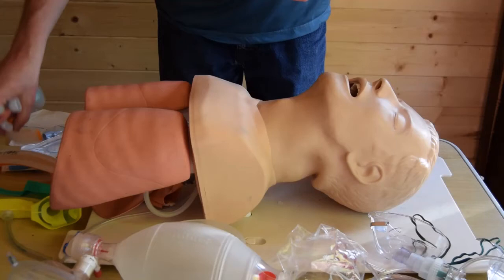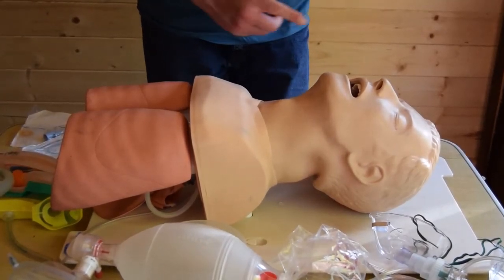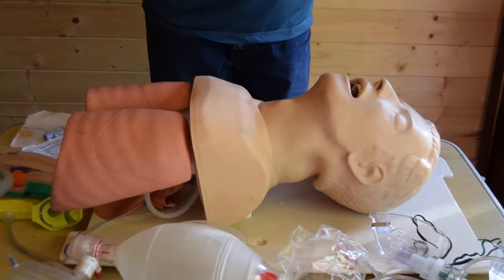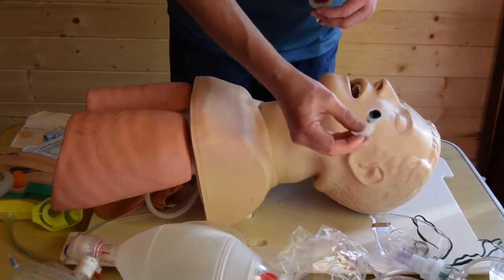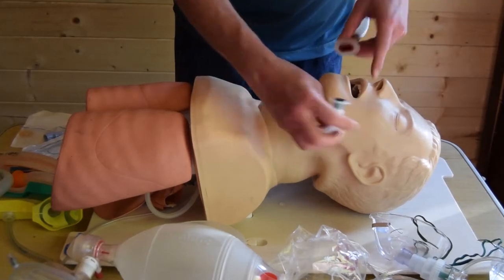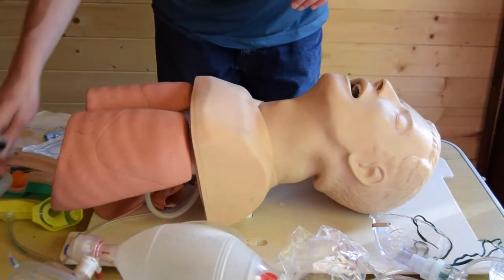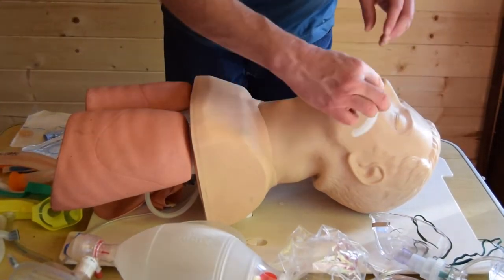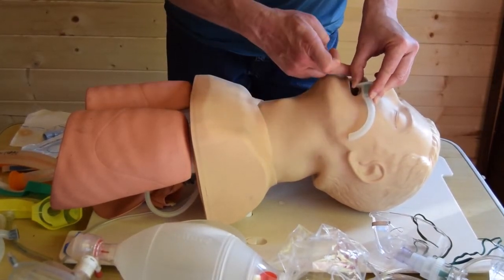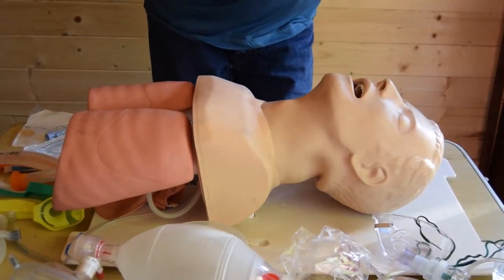So in order to size the airway, if you imagine where this airway is going to go, it's going to sit by your teeth and it's going to go down the back of your throat. So if we just try this one for demonstration purposes, and if I put that there, obviously it's not even getting past the jaw, whereas a very big one would go right past the jaw, so we need to find somewhere in between. So if I try that one, for instance, you can see it fits nicely around the angle of the jaw and sits next to the incisors. So this is the correct one for this patient.